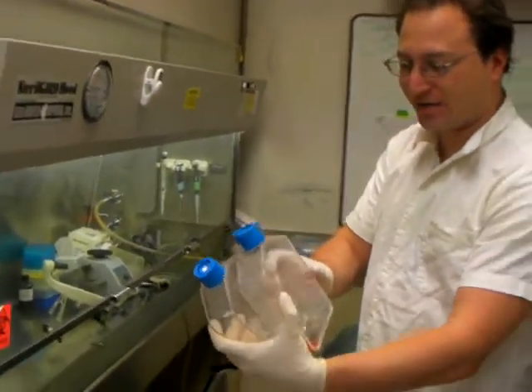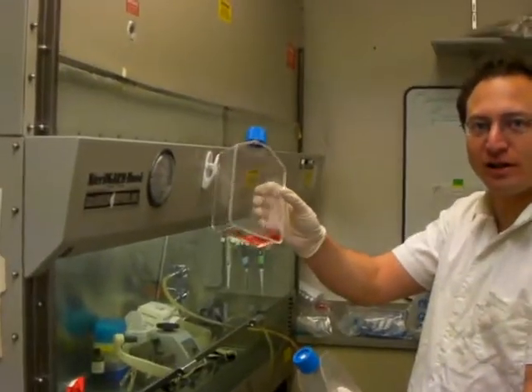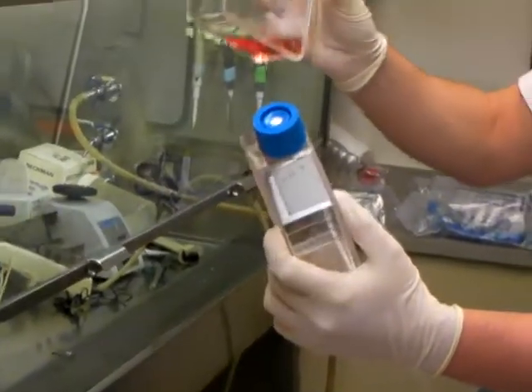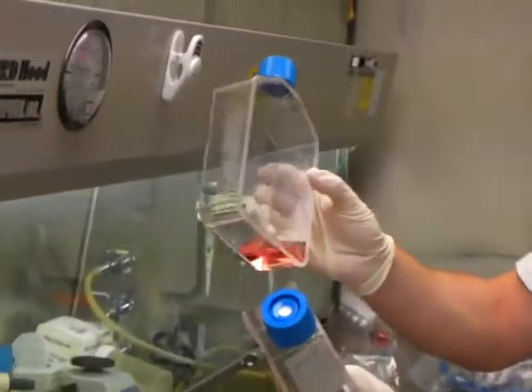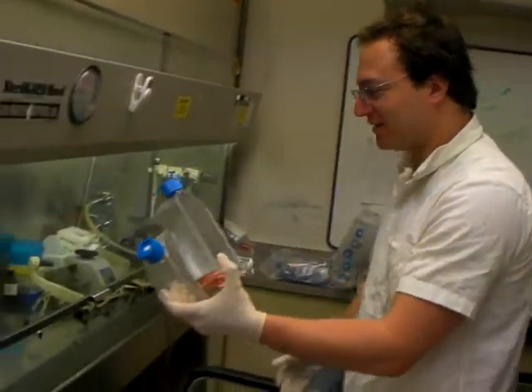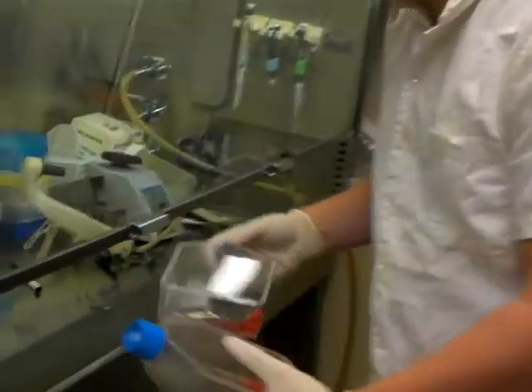I have two cell types. One is non-adherent, so they're floating in here. The other one is attached to the bottom — they're adherent cells. Today I will just be splitting them, which is basically getting them into new flasks for me to use another day. I'll show you how that's done.